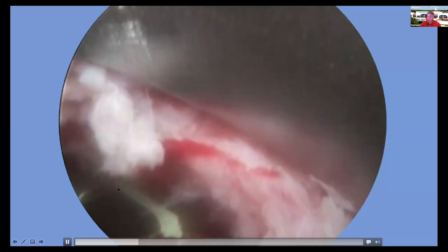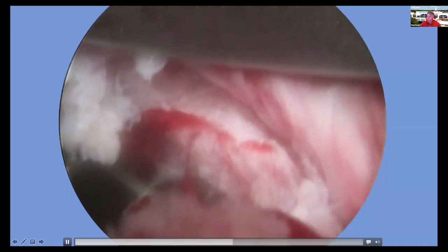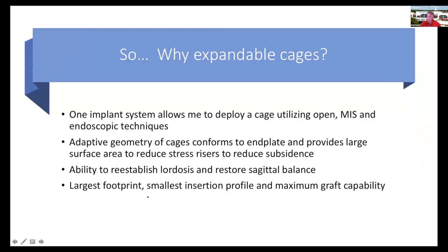Here is an interlaminar case with the FlareHawk 7 deployed. As you withdraw the retractor tube, you can see how the dura was retracted. I demonstrated one implant system that allows me to deploy a cage using open, MIS, and endoscopic techniques based upon what's best for the patient — there isn't one technique that's best for all patients, and I like to have options. The concept of the adaptive geometry of the cages conforms to the end plates to give you a lot of surface area that reduces the risk of subsidence, and expandable cages give you the opportunity to restore lordosis and sagittal balance while putting the largest cage possible in with the smallest insertion profile.